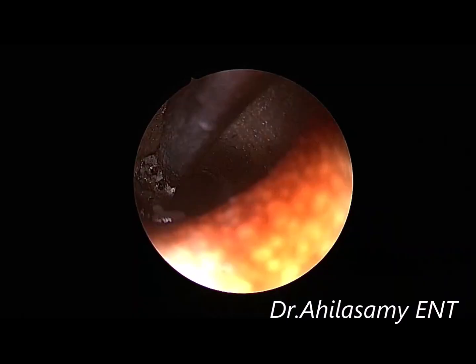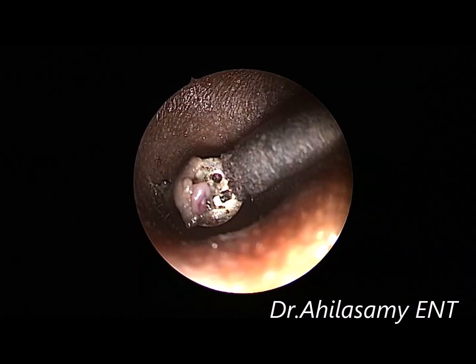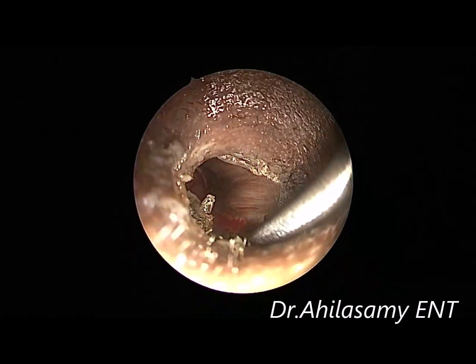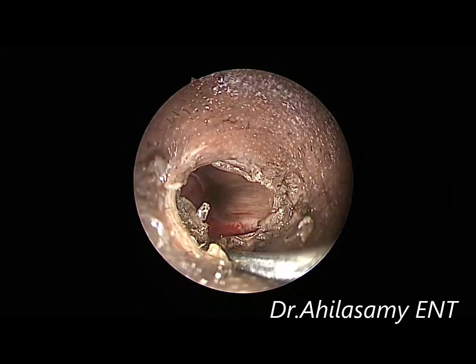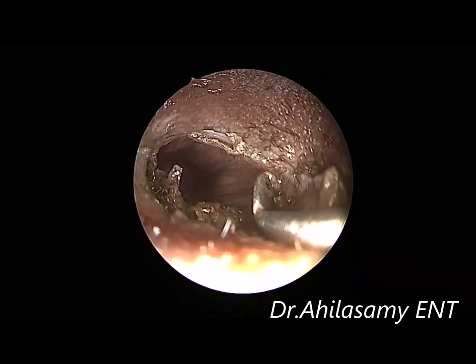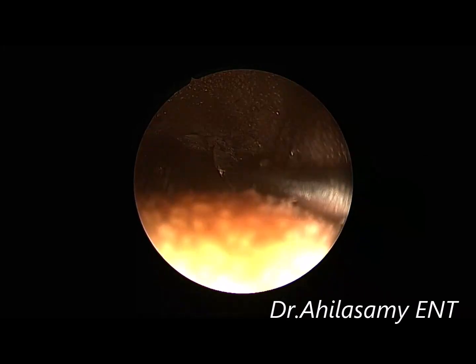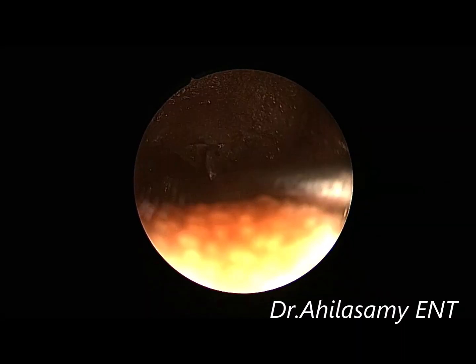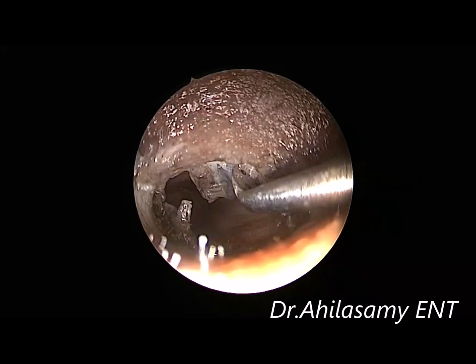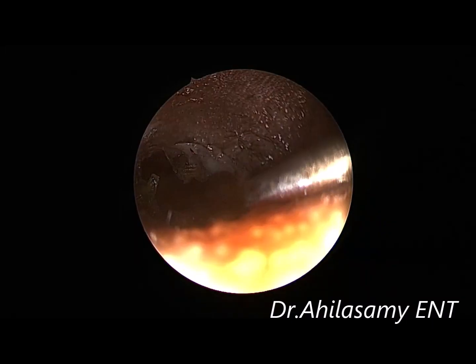This is a minimally edited video. The patient has been taken under moderate IV sedation. Now I am using the regular round knife — of course you can use the same diathermy knife also — to elevate the tympanomeatal flap. Appreciate the feel; the quality is such that there is hardly any bleeding when doing single-handed endoscopic ear surgery.